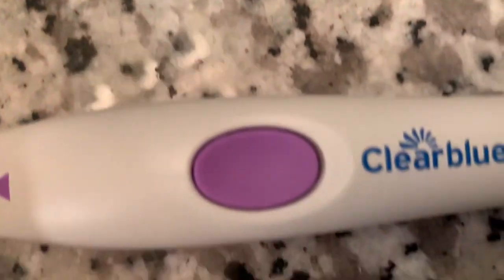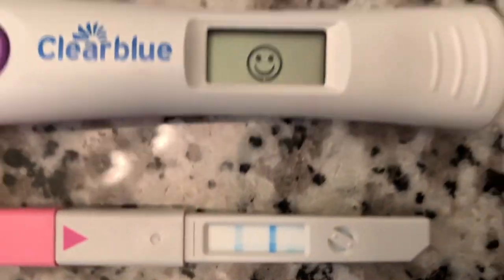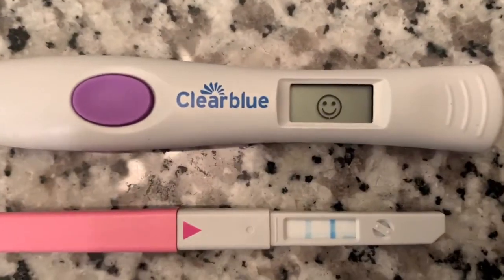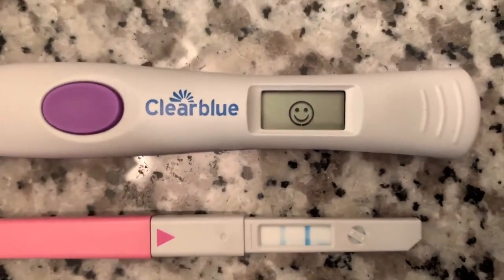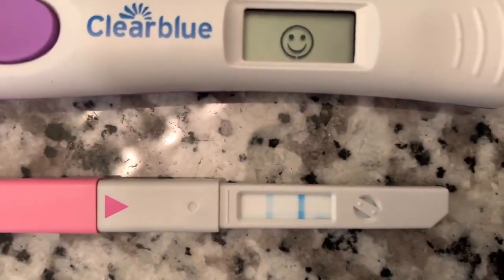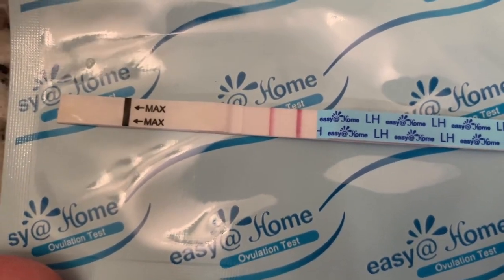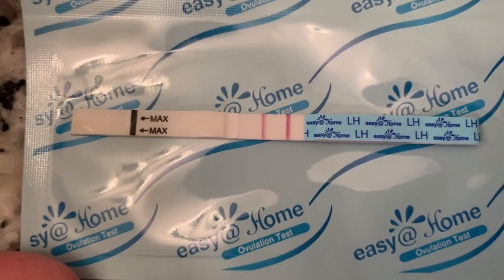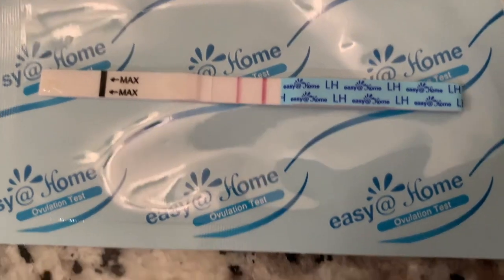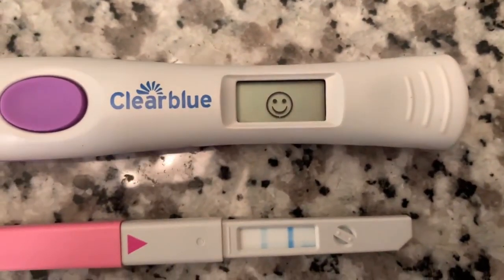That's why I'm all about the digitals. So I am having my surge right now. This is so crazy. So I skipped flashing altogether, so I never flashed. It never flashed ever. And it was very, very light. This is from this morning, second morning urine. Can't even hardly see the line anymore. It was better than that, but then of course, tomorrow this will probably match a lot better in the afternoon. I'll go ahead and test tomorrow and see what it ends up looking like. But I guess I am ready to inseminate tomorrow morning.